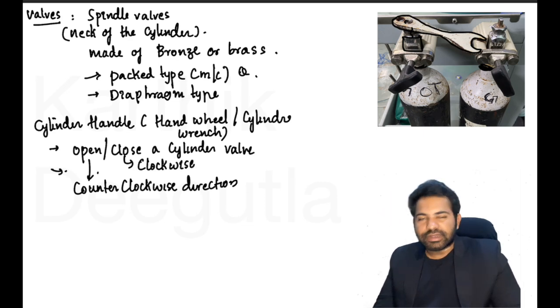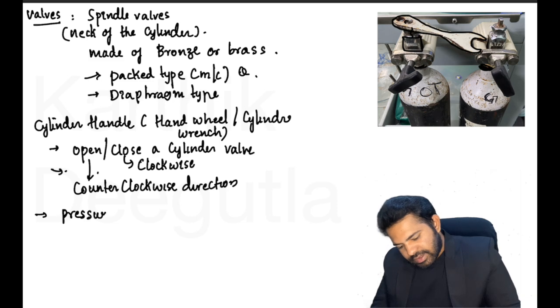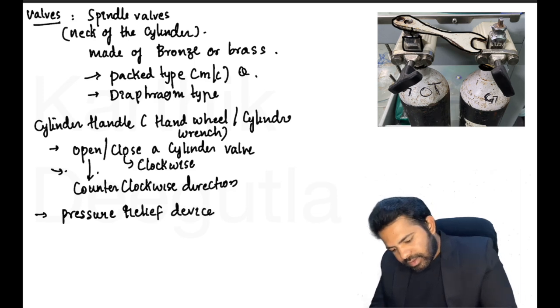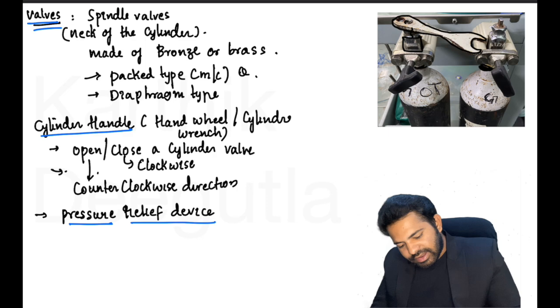Then we also have a pressure relief device. We have valves, we have the cylinder handle, we have a pressure relief device. The pressure relief device is used to vent out the gases.